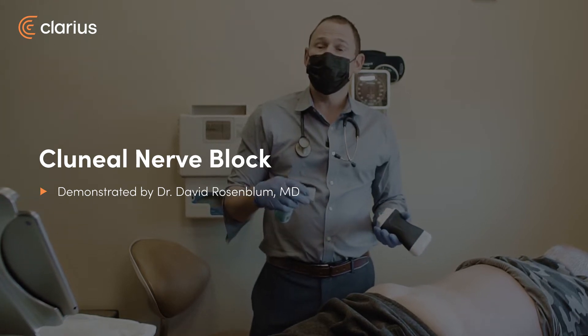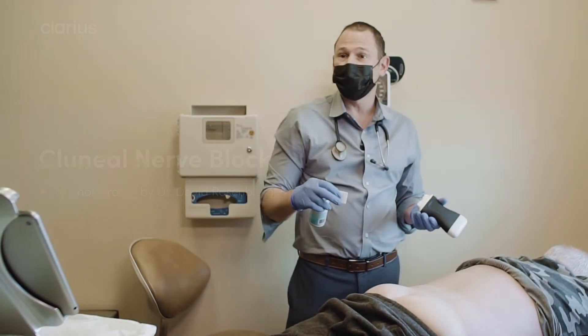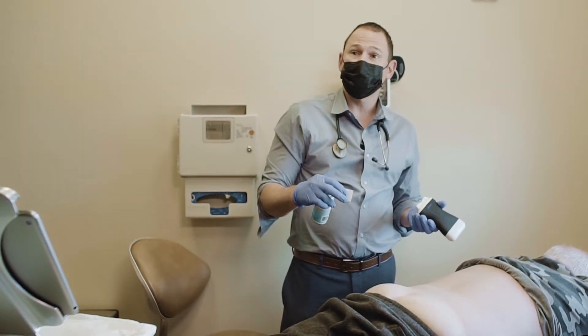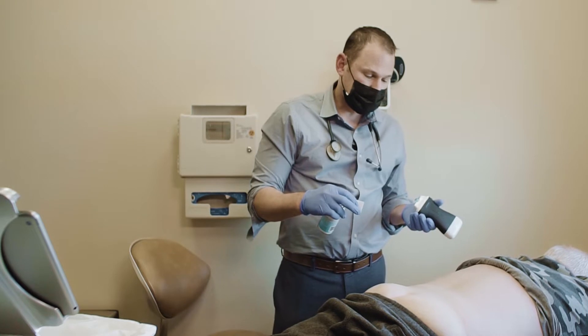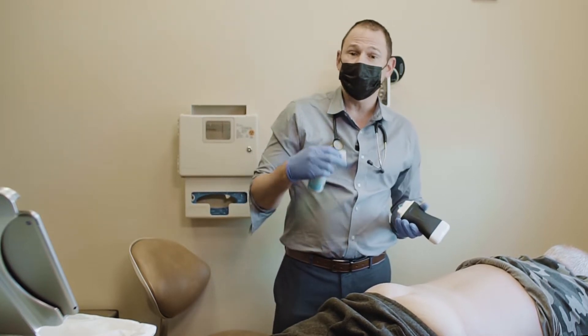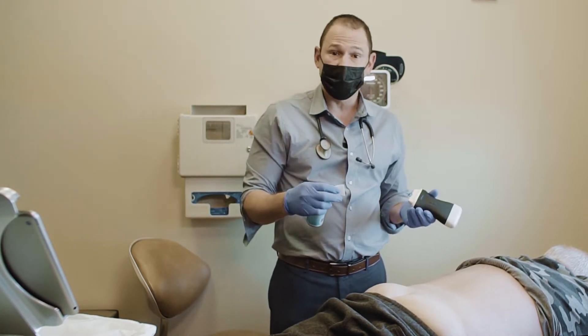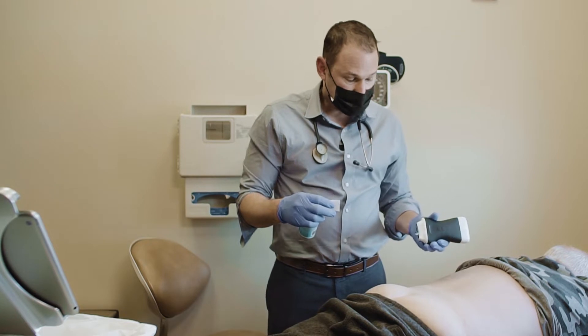Once again, we're going to treat superior cluneal neuralgia in this patient who's had multiple cluneal nerve blocks. He's had the medial, middle, and low branch blocked with excellent short-term relief, and now he's here for a cryoablation with the Iovera device for the long-term treatment of his pain.